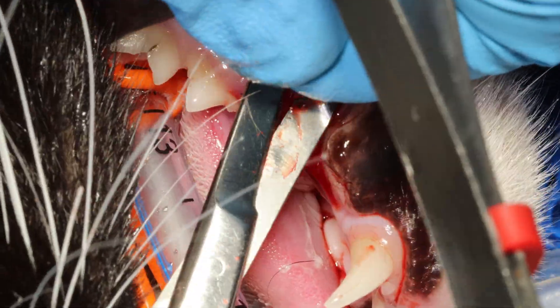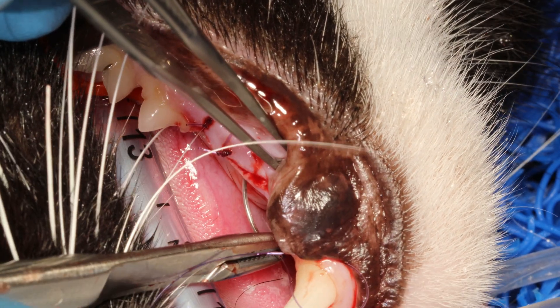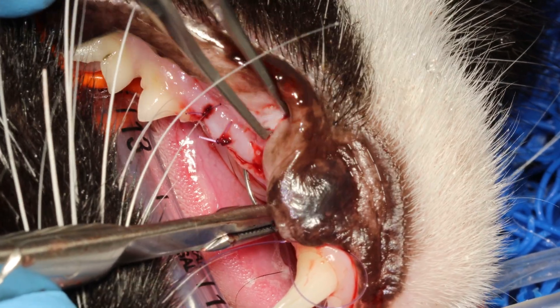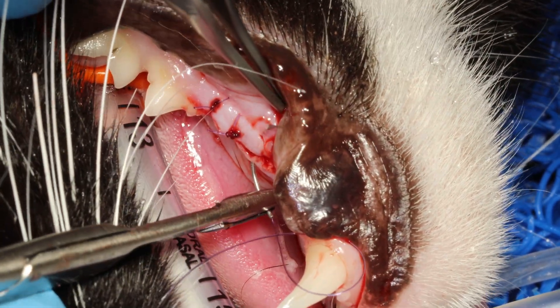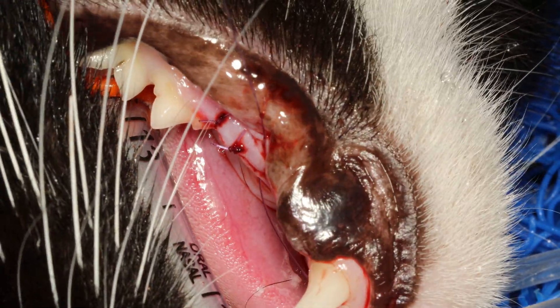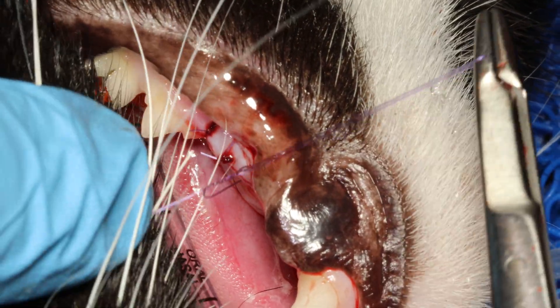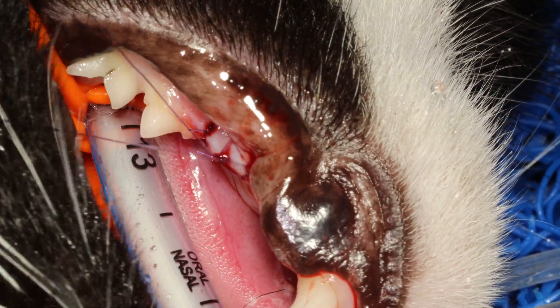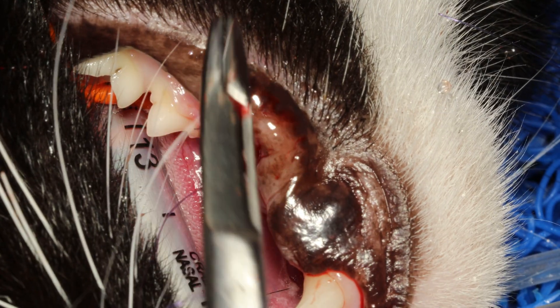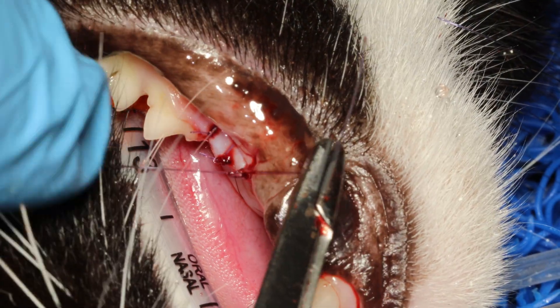Make a surgeon's knot — a double throw and then three throws on top of that. There is a tiny hole here because I cut it out; I was doing a suture and then changed my mind and pulled it out. So I am going a little bit deeper this time to make sure nothing is going to pull through that gingiva. This will absolutely hold because there is no tension at all.